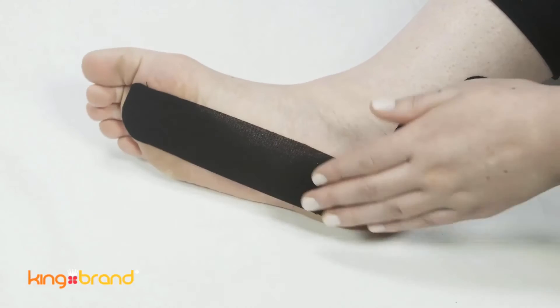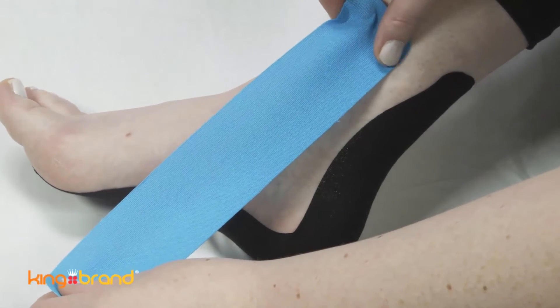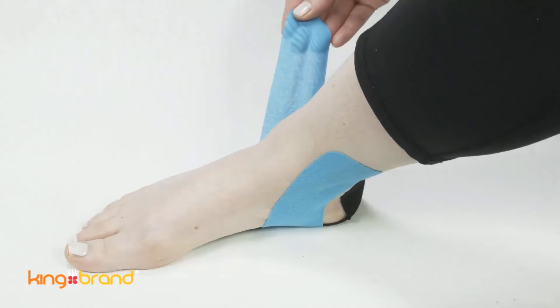Take another 10-inch piece of support tape and anchor it on the inside of your ankle, just above your ankle bone. Stretch the tape down the side of your ankle and around the bottom of your foot to the opposite ankle bone.